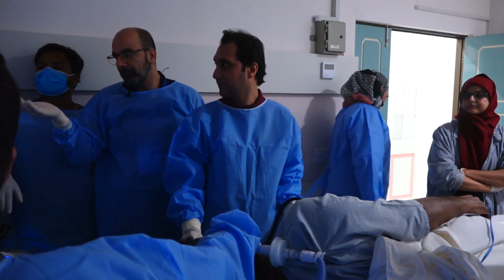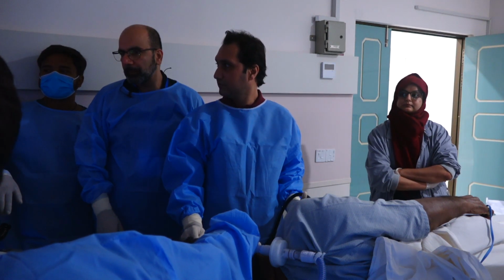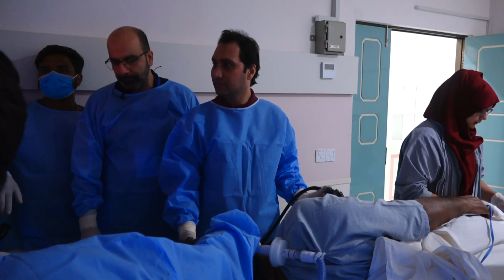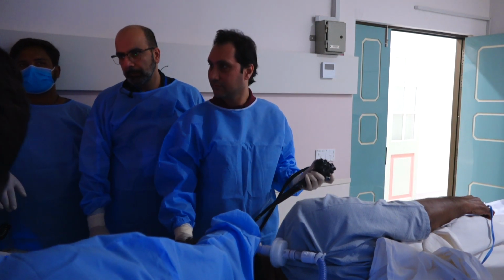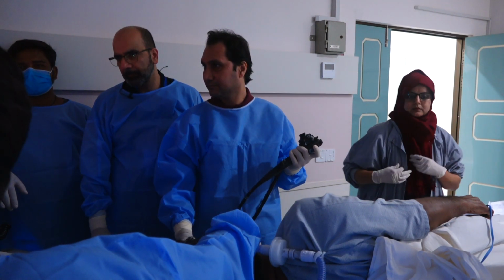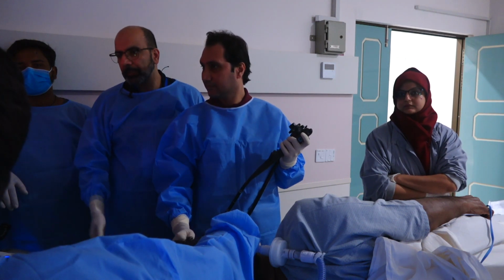So now that we're here, again, first step is to look for the liver, right? So you're going to move the big wheel towards you a bit, and then just go clockwise. Good. There's the liver coming into view. Keep going. Don't push in. Pull back a bit, and keep going clockwise.